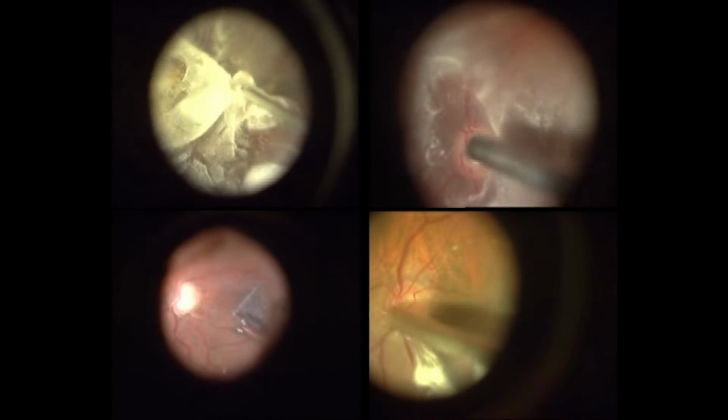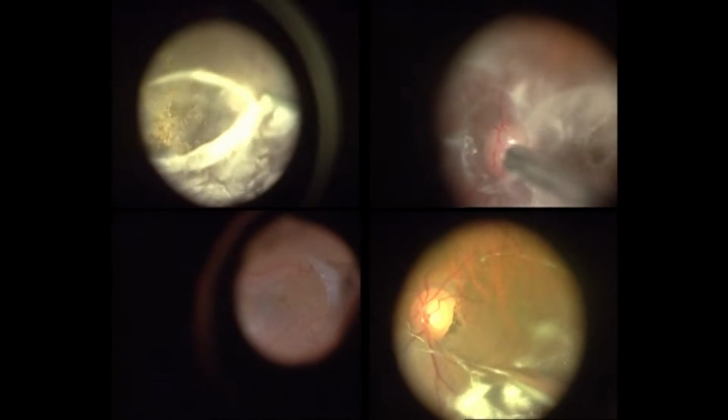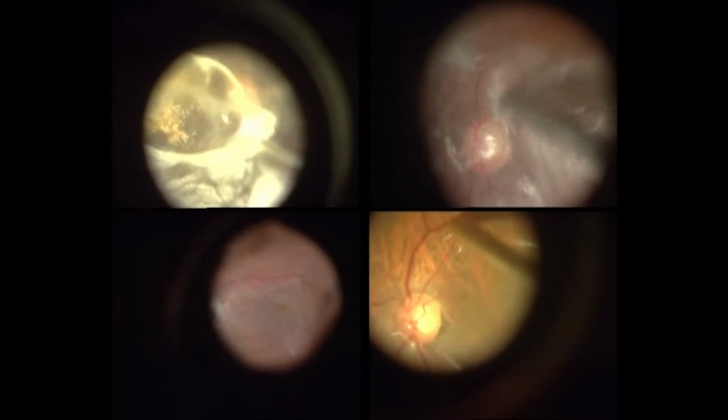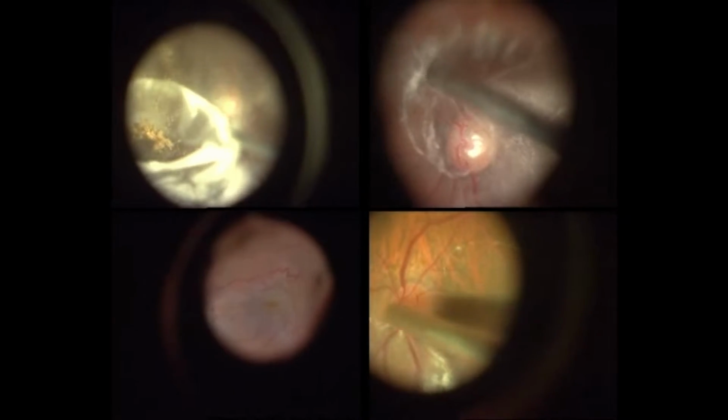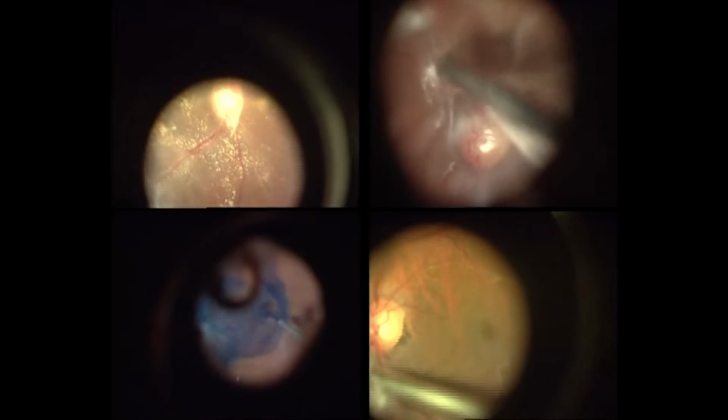There are several techniques for inducing a posterior vitreous detachment intraoperatively during pars plana vitrectomy. In this video presentation, we demonstrate the technique of inducing posterior vitreous detachment, various intraoperative situations such as the presence of vitreoschisis, epiretinal membrane, premacular bursa, and also the management of complications such as development of retinal tears and retinal hemorrhage during the procedure in patients with abnormal vitreoretinal adhesion.